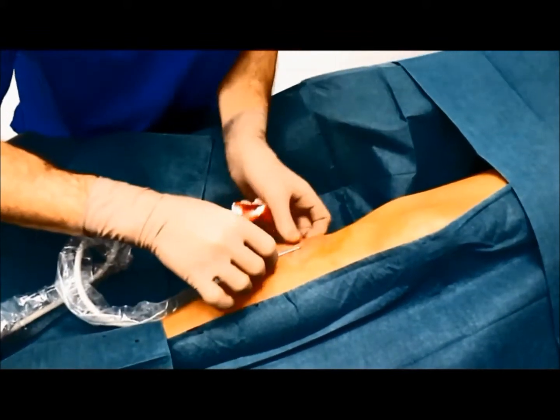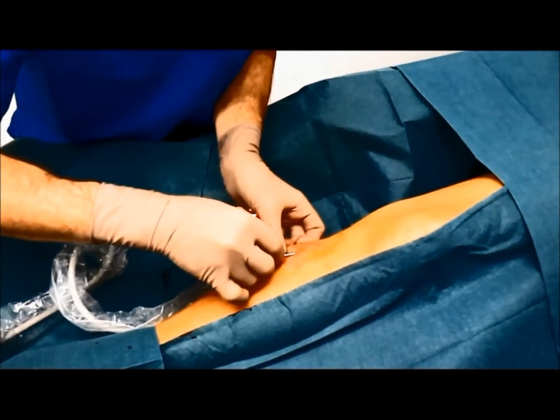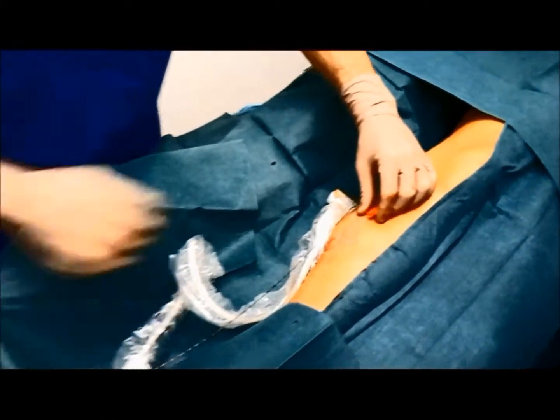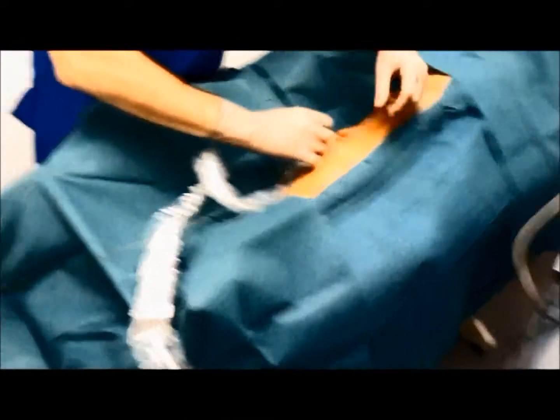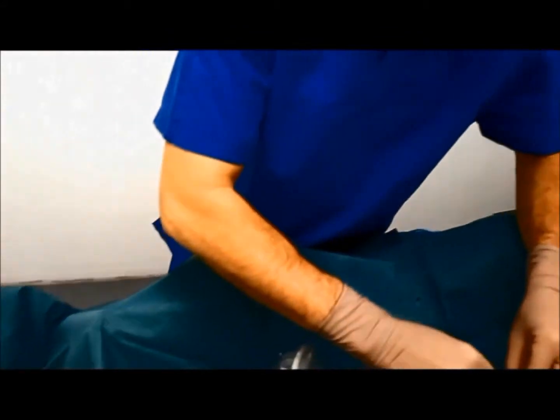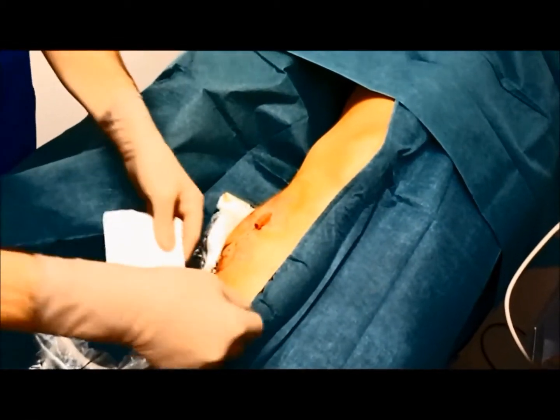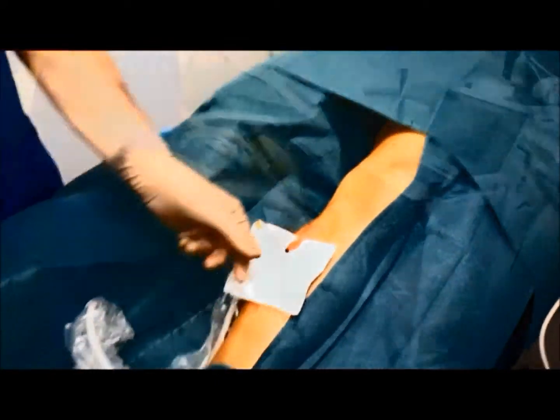The system doesn't use thermal energy, so there's no need for tumescent anesthesia along the course of the vein, and the vein can be treated over its full length without concern for thermal injury to nerve, skin, or muscle. The elimination of tumescent infusion decreases patient discomfort while shortening procedure time.